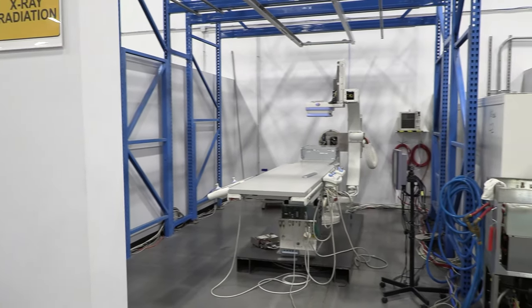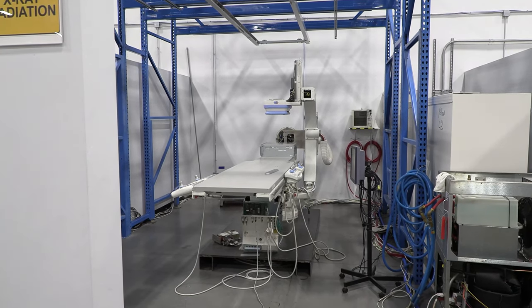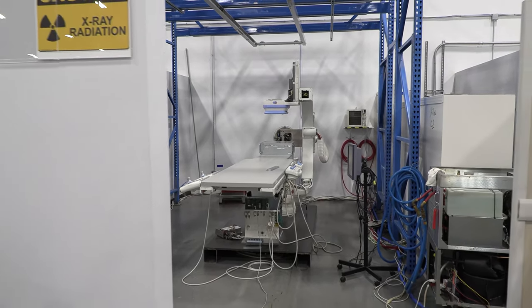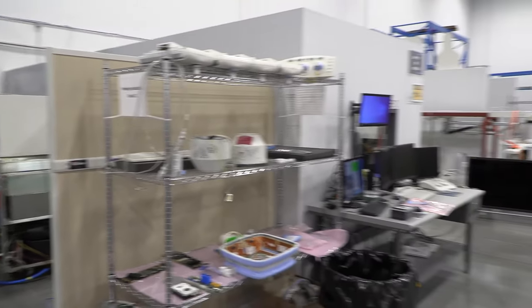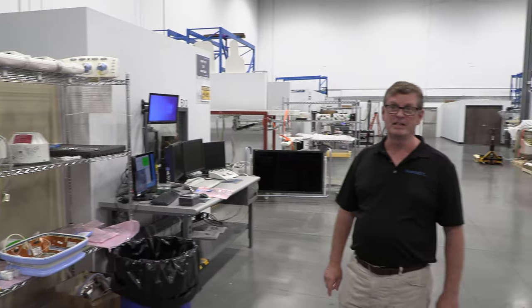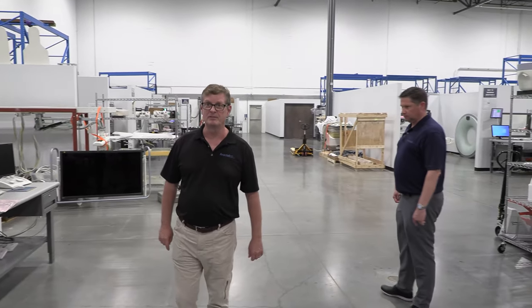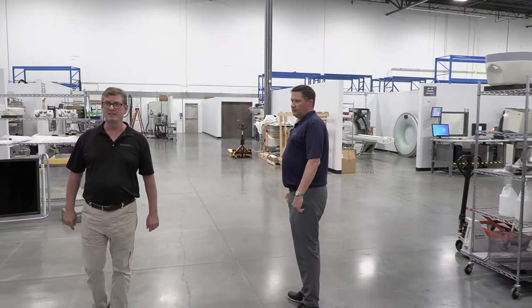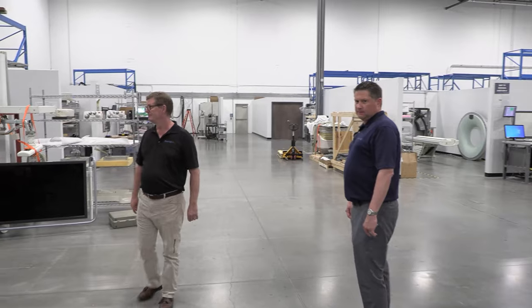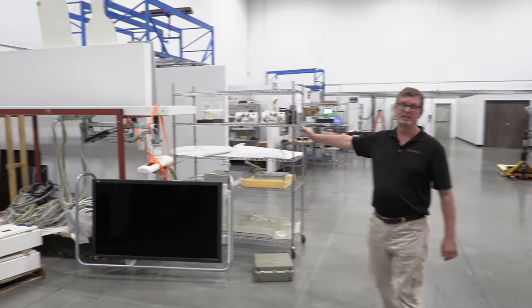Do you guys have a variety of different electrical already staged in these rooms? Because different systems require different power sources, right? When we laid it out, we had the electricians come in and put the proper power into each bay. 480 three-phase is the predominant one. There are a couple others that need a separate feed, different amperage. This whole first section here is all General Electric.